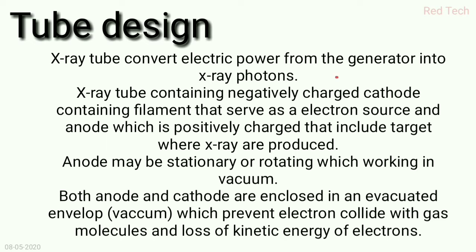Basically, we're going to study the X-ray tube in parts. We study today part 1. In this section, we just do a quick review about the X-ray tube, actually, what is in the X-ray tube. So let's begin. Tube design.